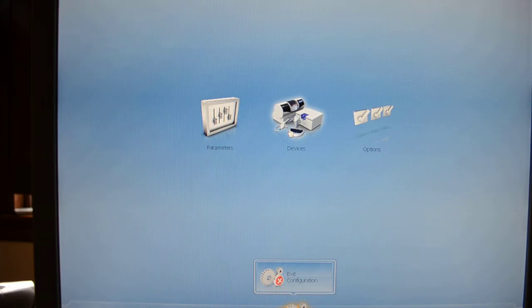It also deals with whatever milling machine you have, and there are two types of milling machines that you can presently use in your office. One is called a compact unit, and the other one is the MCXL. MCXL is a little more robust. It will mill your restorations more quickly, a little more quietly, but both units are pretty nice. Kind of like buying an entry-level car versus the Mac Daddy car, the MCXL being the Mac Daddy. And then options, again, like any other computer program, you can set up options for your CEREC to your specifications.